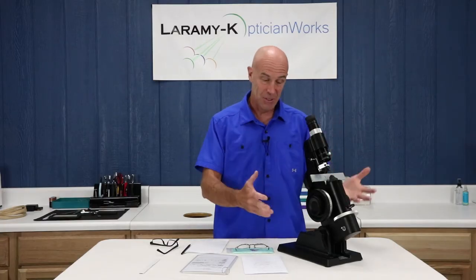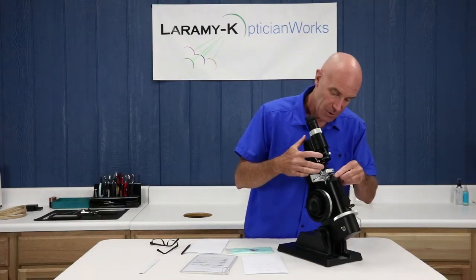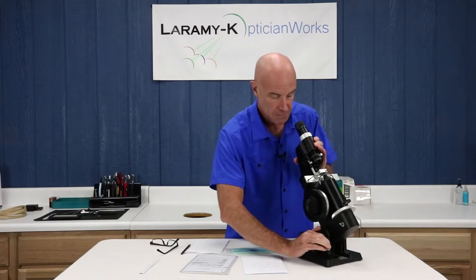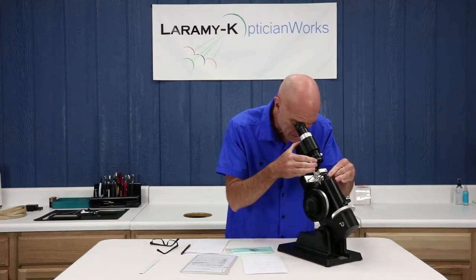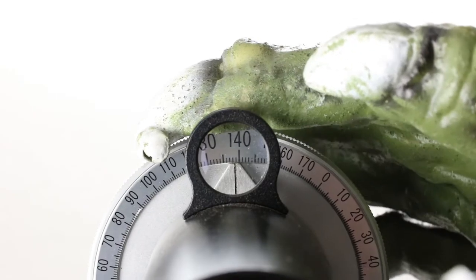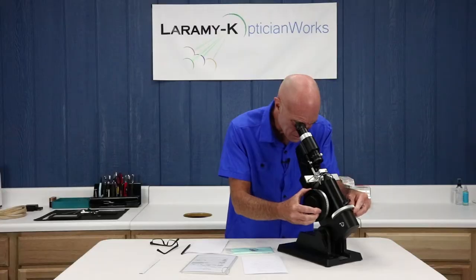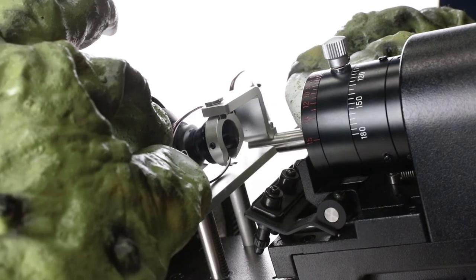After that, it's just kind of the lens meter waltz. Right lens — rest it against the lens stop, turn it on, get it comfortable, get things lined up in there, turn your axis wheel, turn your drum, do whatever you need, move things around.